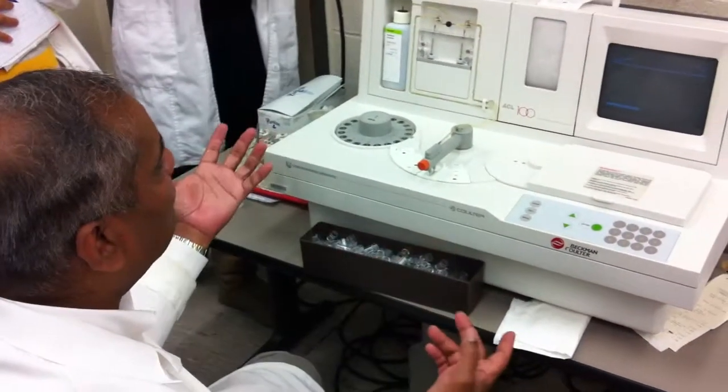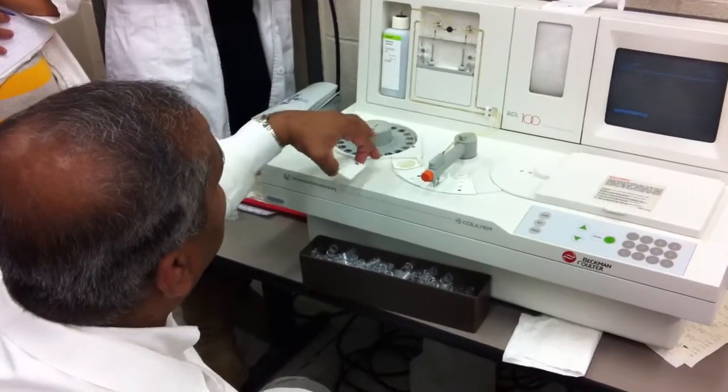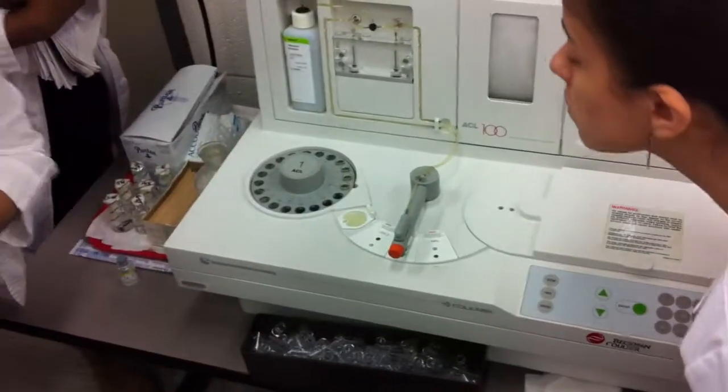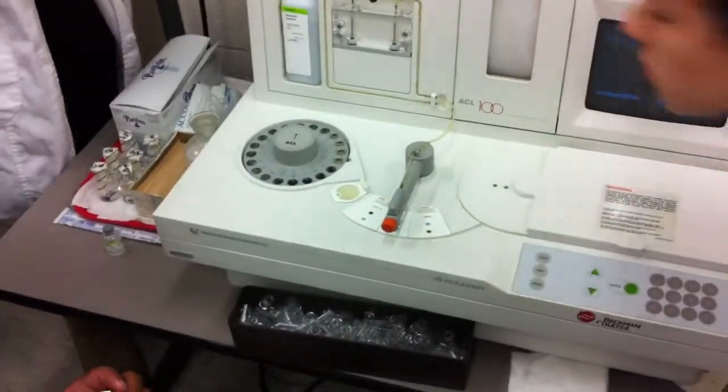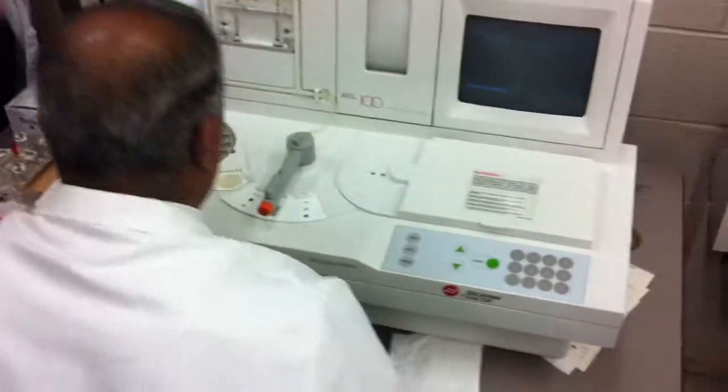You're going to remove and clean it. Now, if you look in these reagents, there's a little spinner in there. It's a magnetic spinner. It's in both the PT and PTT. See it spinning in there?